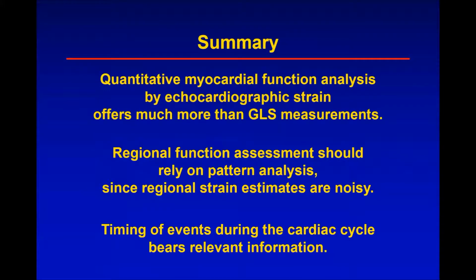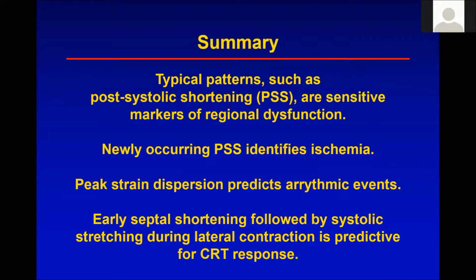So, ladies and gentlemen, despite the few interruptions by the internet problems, I would like to summarize that we have a lot of possibilities to quantify myocardial function by echocardiography, and there's much more than just global longitudinal strain. Regional function assessment should rely on pattern analysis, since regional strain estimates are always noisy. The timing of events during the cardiac cycle can be relevant information, and you should keep that in mind. We have typical patterns such as post-systolic shortening, which are sensitive markers of regional dysfunction.